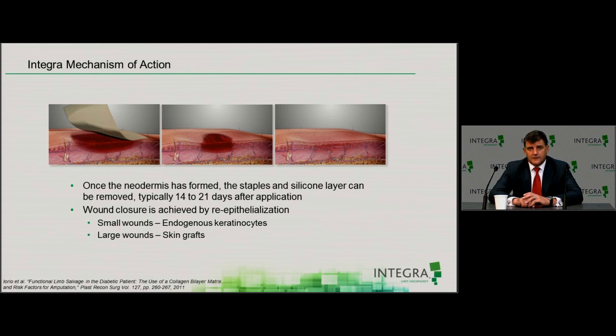However, our experience is in a lot of our significantly larger wounds, which may range from anything from 10 square centimeters to 600 square centimeters, we really generate a dermis, and then we close it later with a split-thickness skin graft or some other skin therapy, whether that's an epidermal bullae grafting or some other technique.